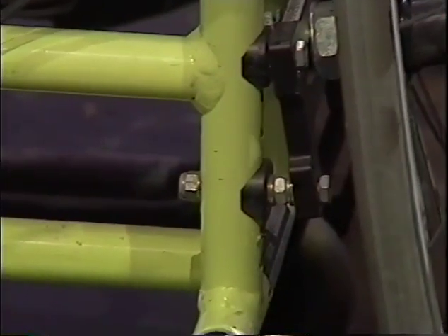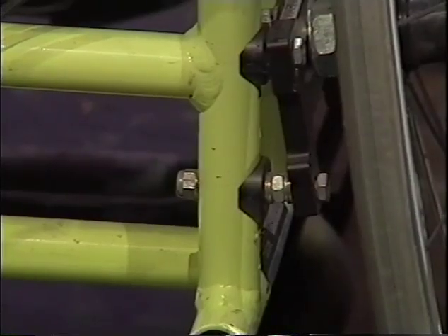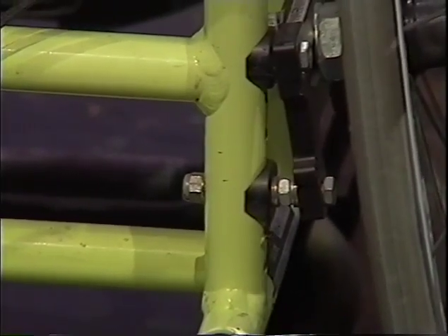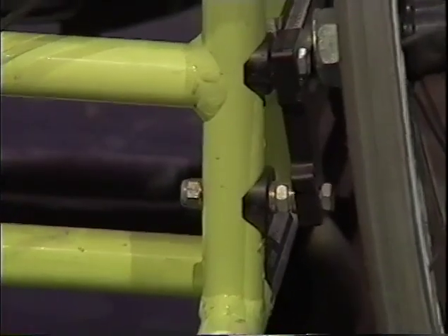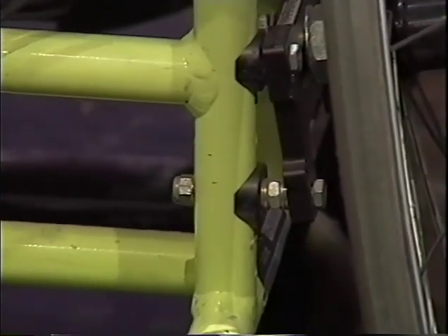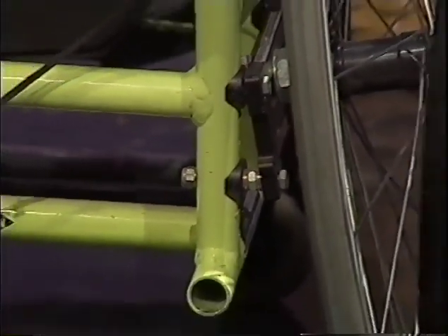And these spacers kick the bottom of the plate out, and it gives the wheel more camber, which basically helps the chair to turn. And also it keeps the forces of the wheel in line with the spokes. So when a lot of weight goes on this wheel, it's made to carry that weight instead of having it straight up and bending the wheel over.